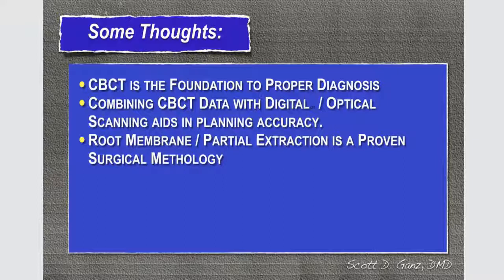I think we know after at least 10 years or more of published research that the root membrane or partial extraction therapy is a proven surgical methodology. We're doing more and more of those cases, and you will see more and more of those articles coming out. You'll see multi-center studies coming out as well, and it's very important that diagnosis is important for any one of these procedures, even partial extraction therapy, root membrane concept.